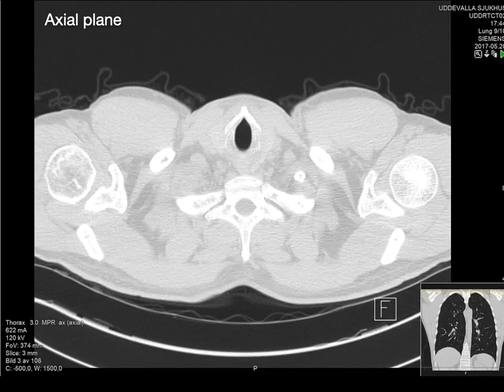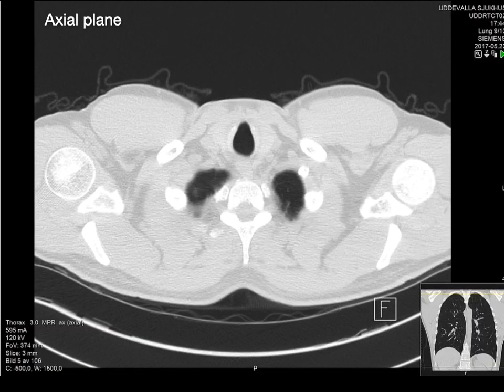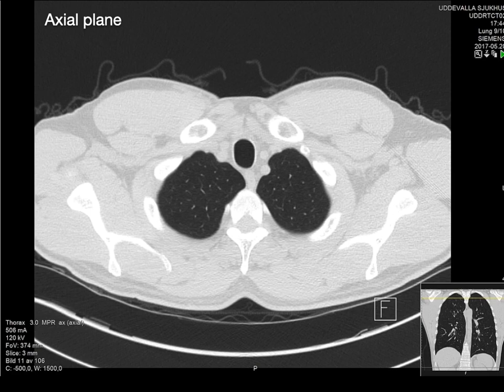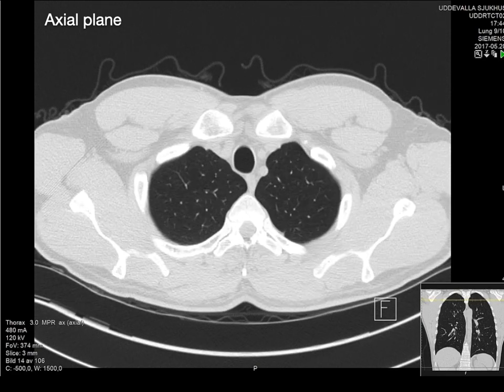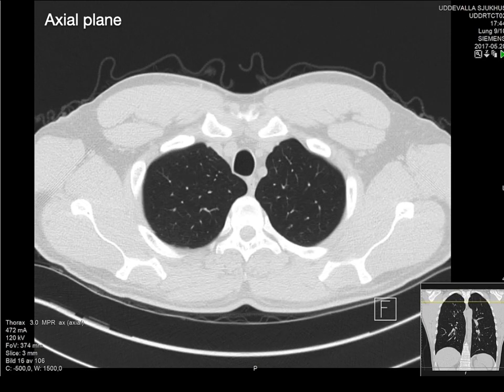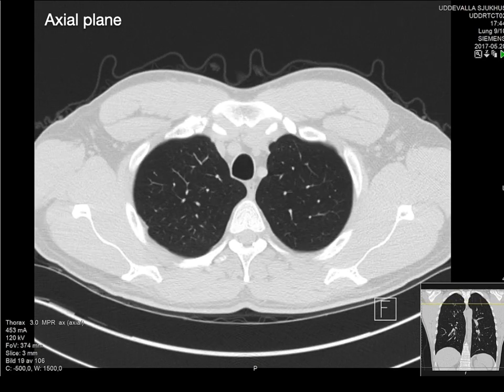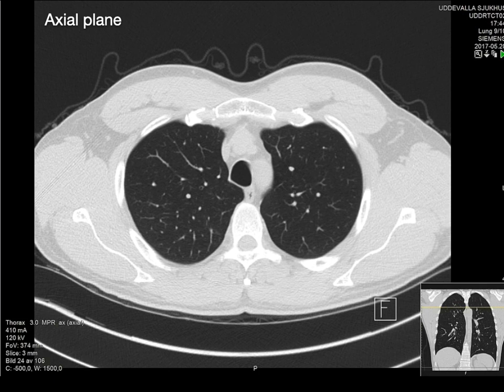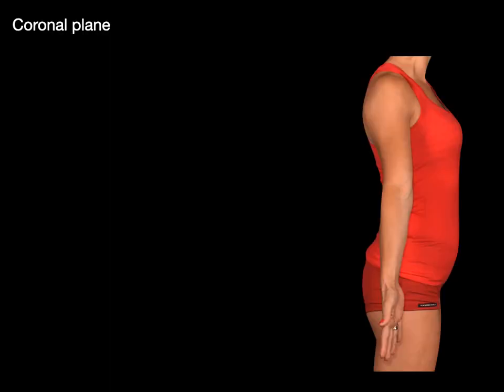These are different sections shown in the axial plane, going down, down, down through the body. It's really cool to see the anatomy in these different views.